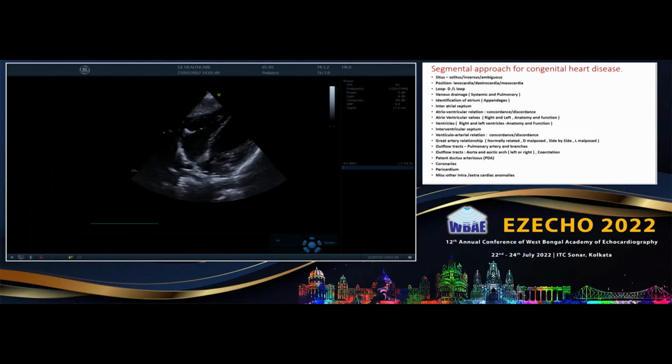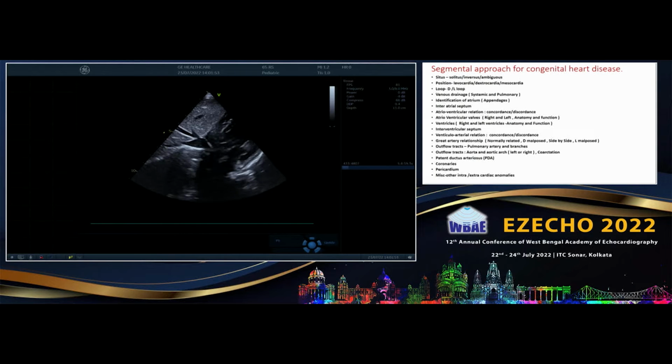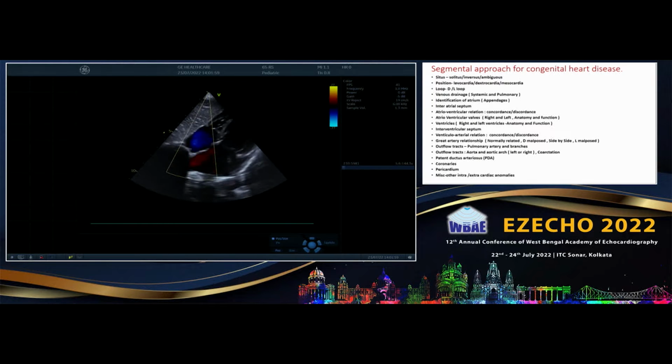Frequently you can see the hepatic veins and the IVC draining very close by. So the IVC is draining to some chamber, and the question is what chamber it is. It is some sort of atrium, and in 99% of cases the IVC drains into the right atrium.